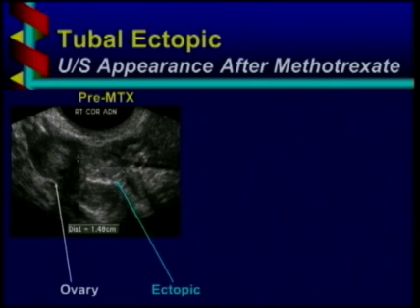We did the ultrasound. There was nothing in the uterus. There's the ovary, and we saw an adnexal mass, a right adnexal mass, sitting between the ovary and the uterus, and we said correctly, it was the correct thing to say, this is an ectopic pregnancy. You can see that it's measuring about 1.48 or about 1.5 centimeters.